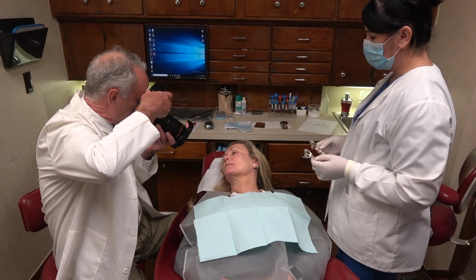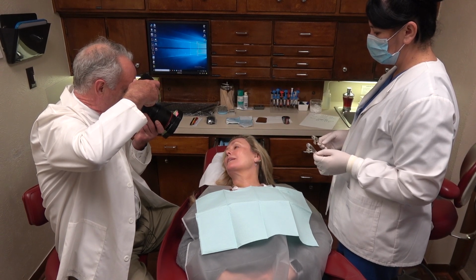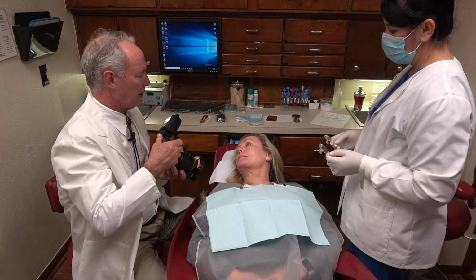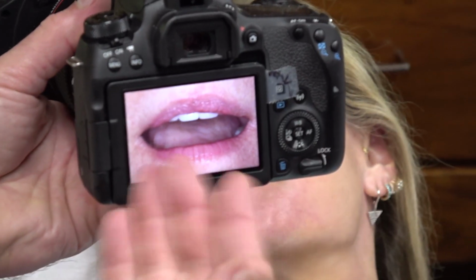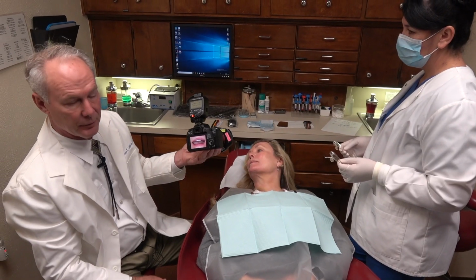Now this is just of the smile. Say big cheese, please. Cheese. Now lick your lips and let your lips just hang. Just say, good. This is showing lips in repose. Remember, you always want to have some tooth display with the lips in repose.